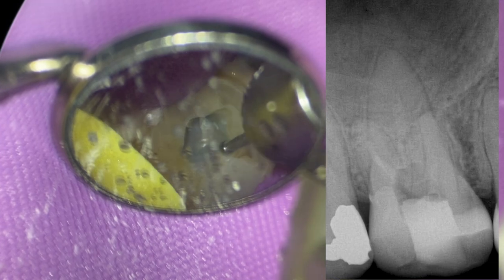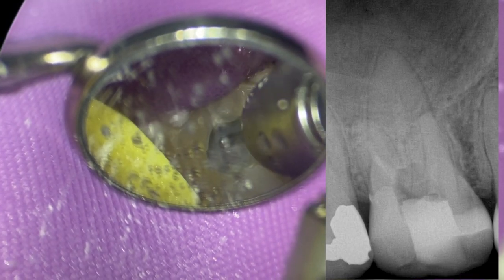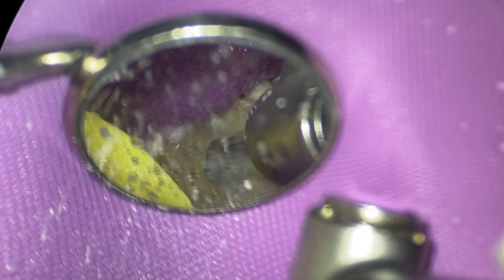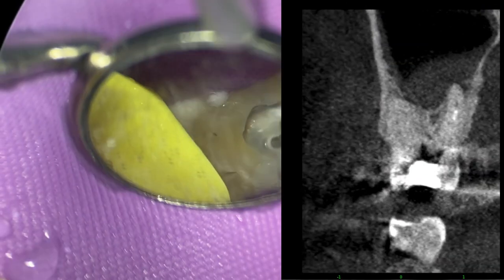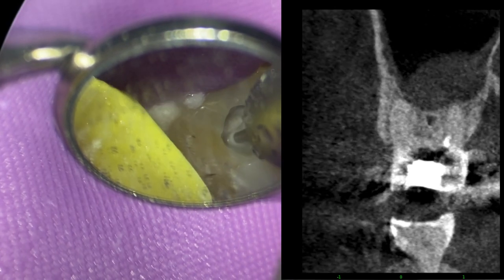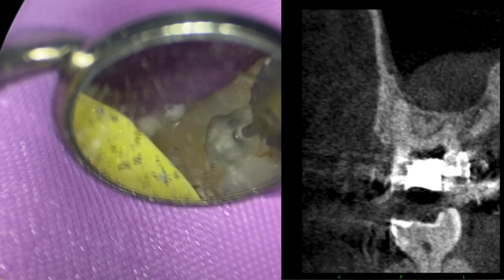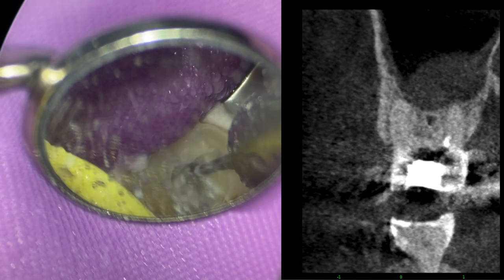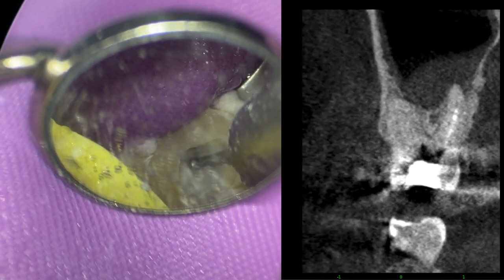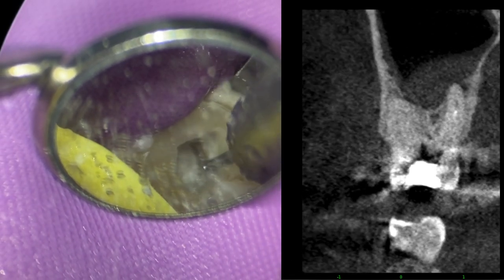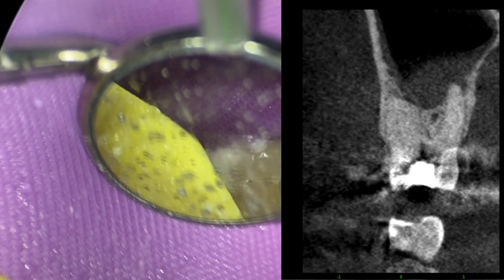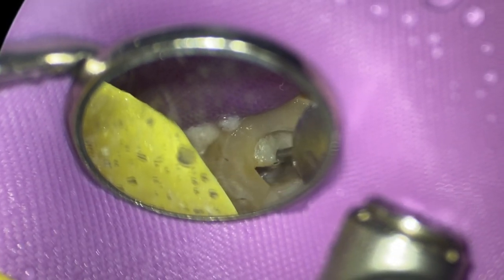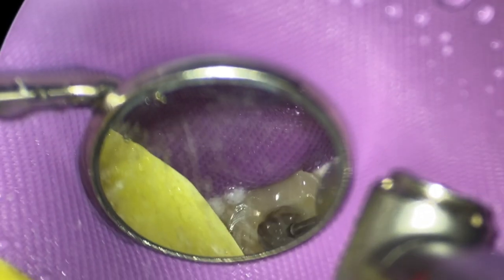There's a whole bunch of information that we looked for in advance, kind of little details. If we get down it, that's great MB2, but if we don't, then what's our option? At the end of the day, I want to talk about that. It's going to be apical surgery, but this patient's going on a trip. We're going to be able to better talk with our treatment plan with the patient because of her cone beam. Without further ado, let's go ahead and get into it.